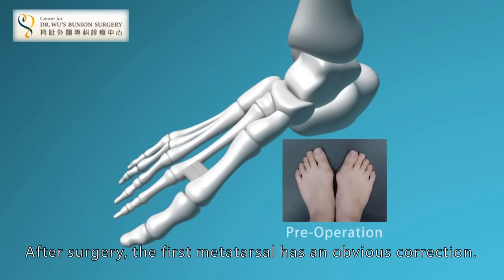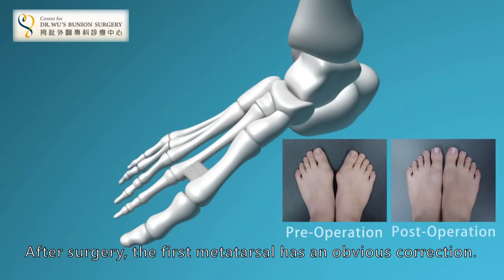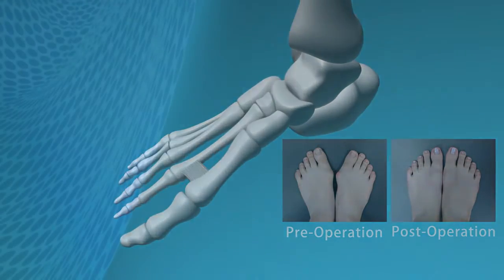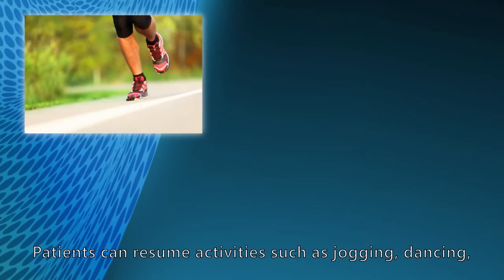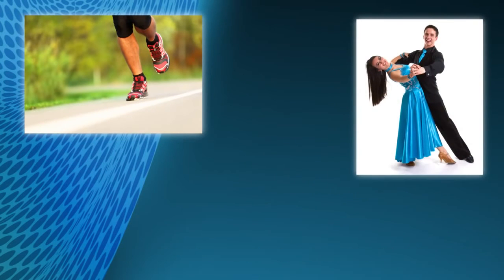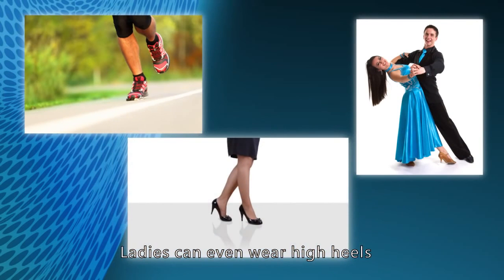After surgery, the first metatarsal has an obvious correction. Patients can resume activities such as jogging and dancing. Ladies can even wear high heels.